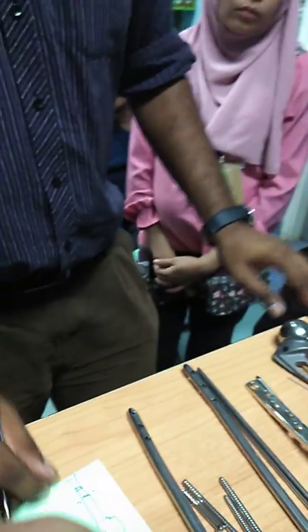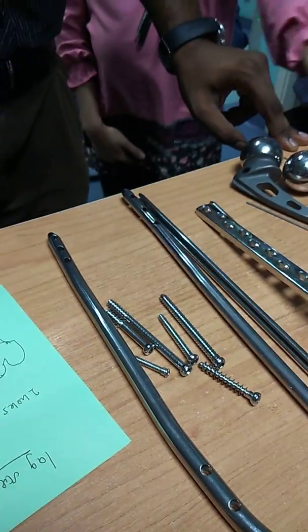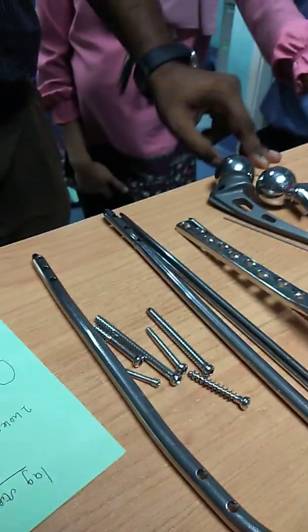The interlocking screws for that, is it specialized for that? You are using a normal cortical screw. Cortical screw. Okay.